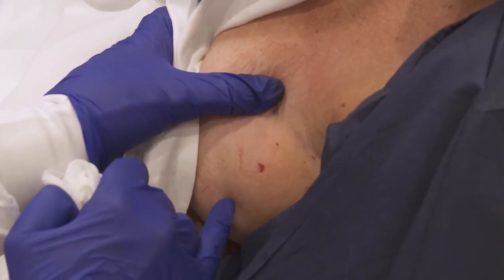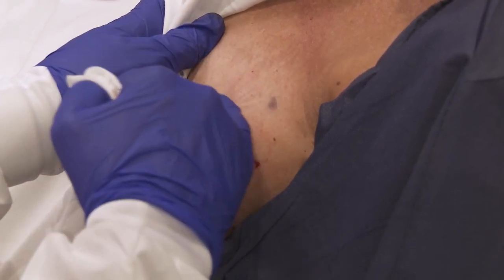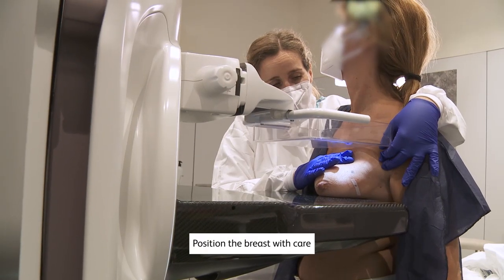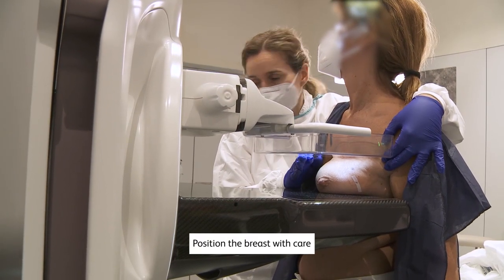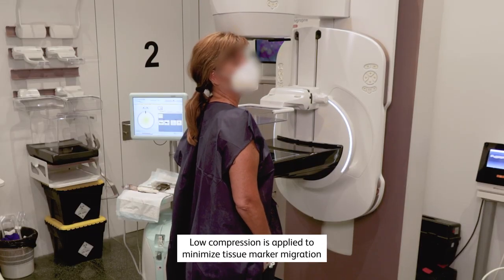Biopsy entry point is shown to the patient, and the area where a hematoma might be visible in the coming hours is shown as well. A wound closure strip is used. Routine CC and ML views are carried out to check the tissue marker placement.